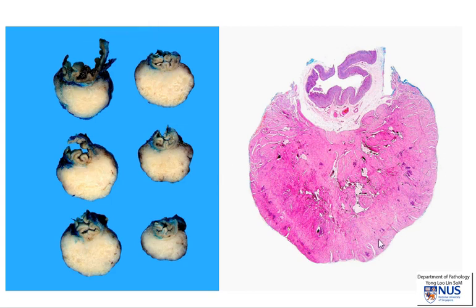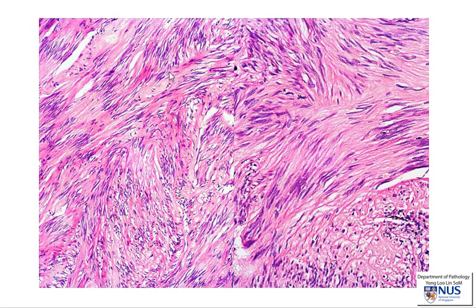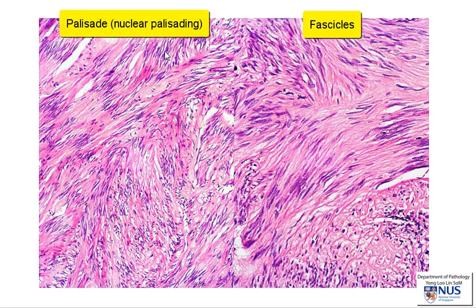The tumour looks relatively pink on low power. Being a mesenchymal tumour, it is usually composed of spindle cells — the cells are very elongated with pulled-out nuclei, and the shape of the cells is also very elongated, very long and thin. Classically, these cells are arranged in parallel bundles, which we refer to as fascicles. Sometimes you can see that the nuclei kind of line up, forming a row, and each row is known as a palisade.